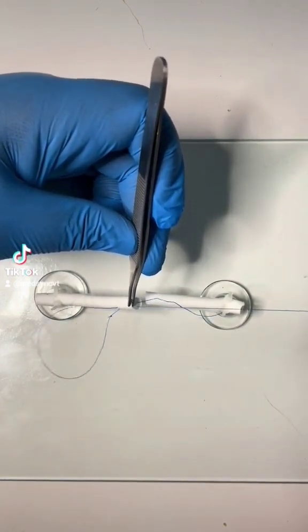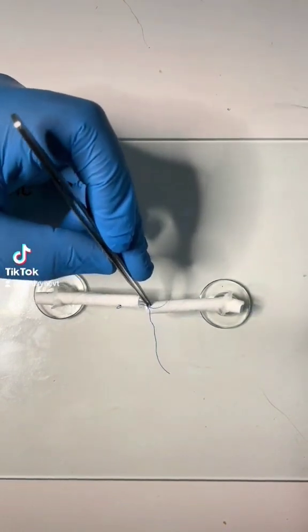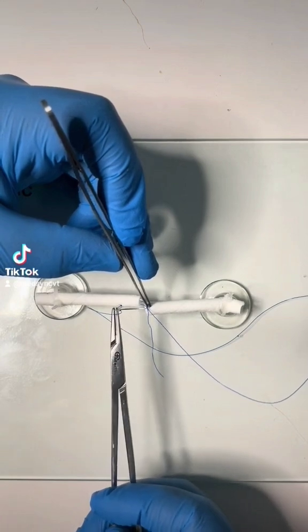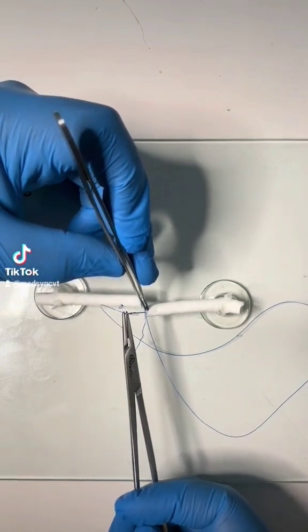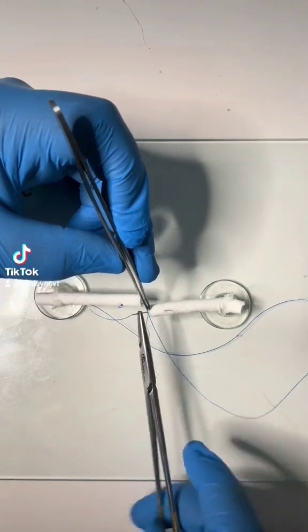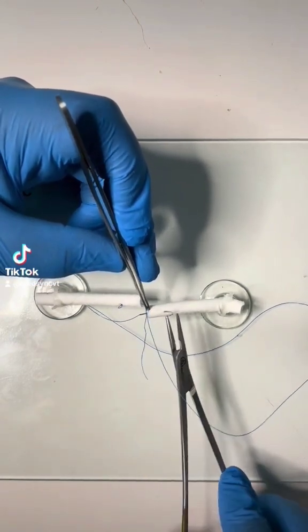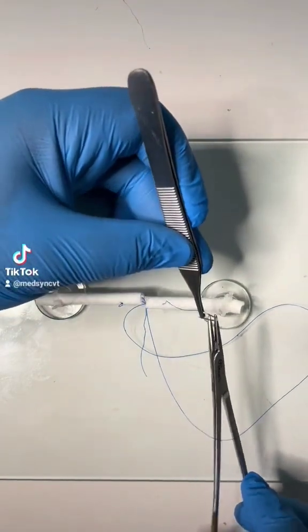Where possible, try and manipulate the tendon only from the site of division — that way you reduce the risk of extra scarring around the tendon. You now need to continue this longitudinal trajectory through the other half of the divided tendon, exiting at a distance of one centimetre from the site of division. As mentioned, try and only hold the tendon at the site of division.